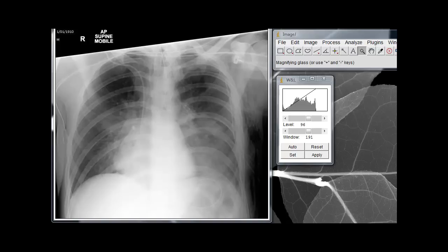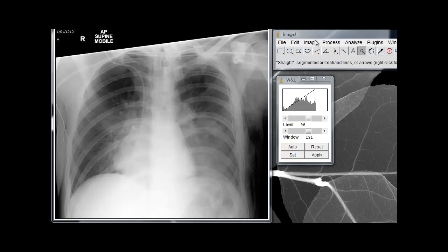I just wanted to do a quick trial video here. I'm trying out this CamStudio software that I just got. First and foremost, I'm using CamStudio, and I'm also using a software program called ImageJ, which allows us to have some basic PACS tools for any image that you can find and save to your computer.